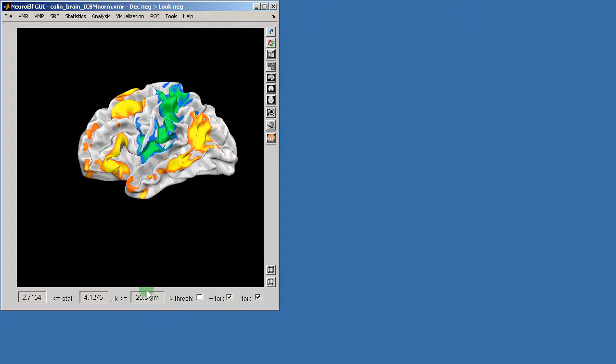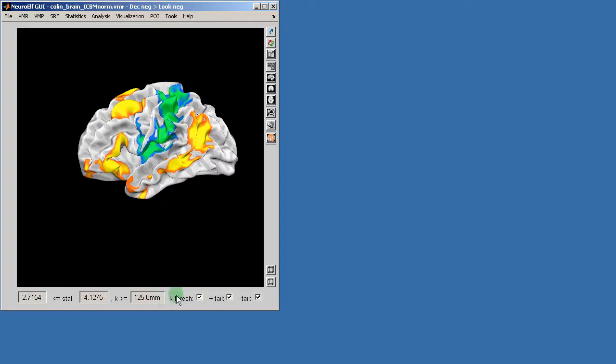Next I will apply the clusters threshold and I will set a relatively large cluster size so that I really only see clusters that I'm interested in.